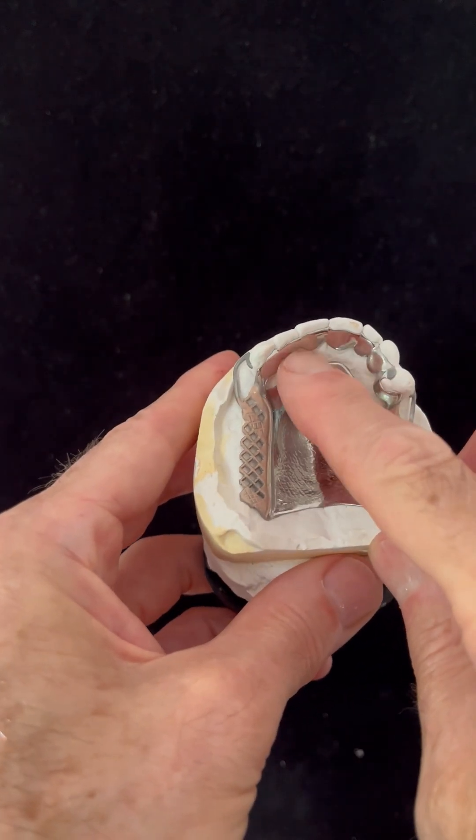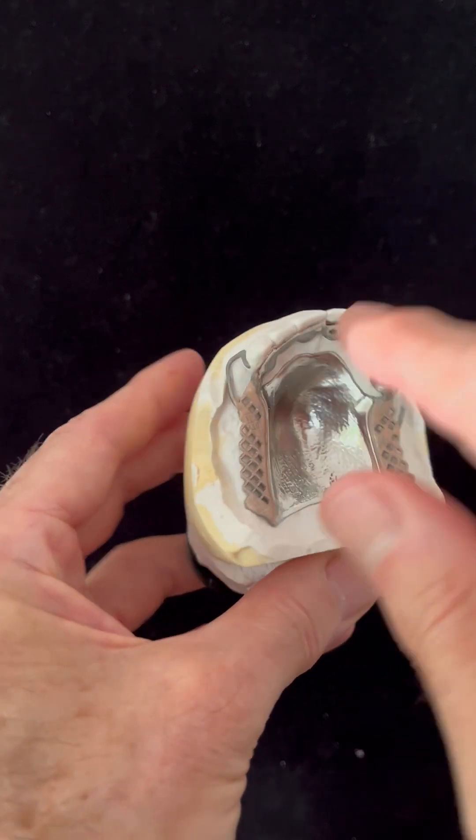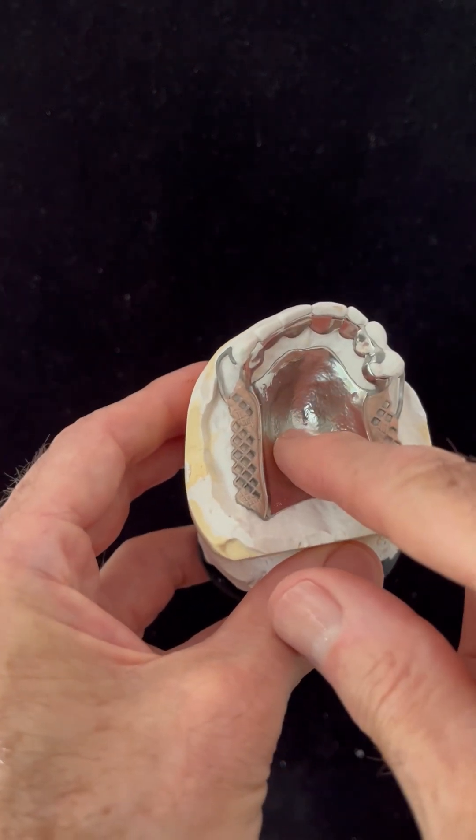So in my opinion, there's no point in creating rest seats on these teeth here, because the loading is not through these teeth — the loading is through the ridge and through the palate.